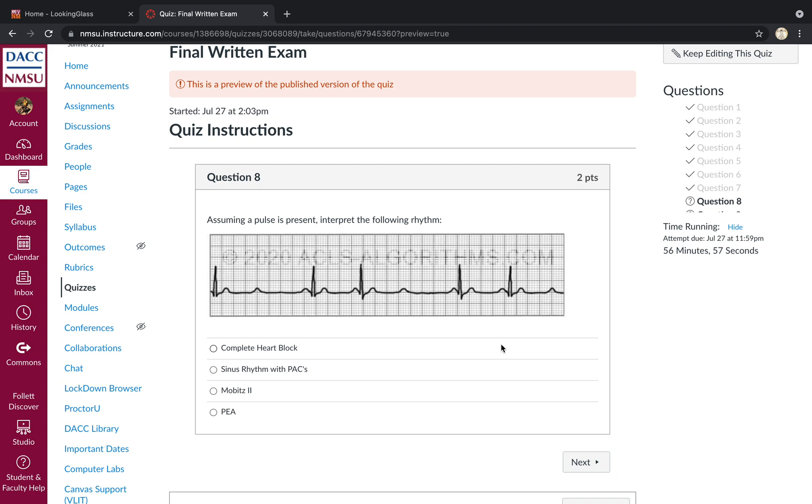Pulse is present. What's your interpretation of the following rhythm? You've got a consistent P to R interval with dropped QRS complexes, i.e. P's without QRS is classic for a second degree AV block type 2 or Mobitz 2.